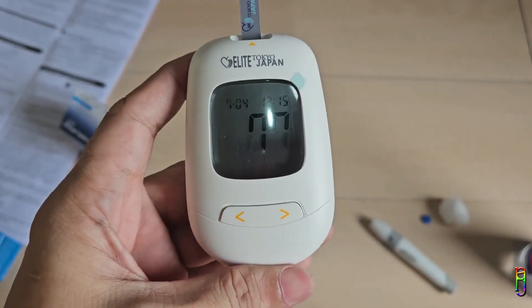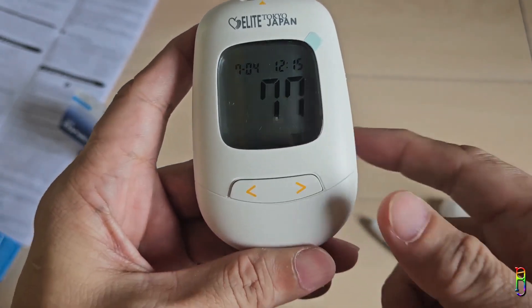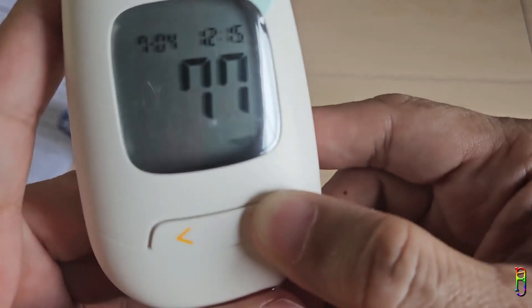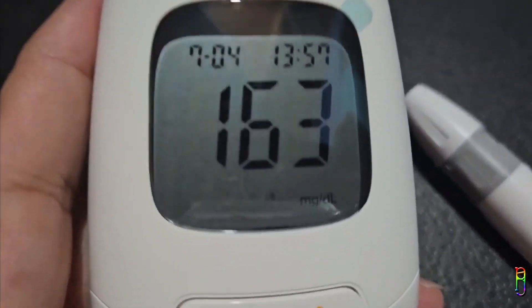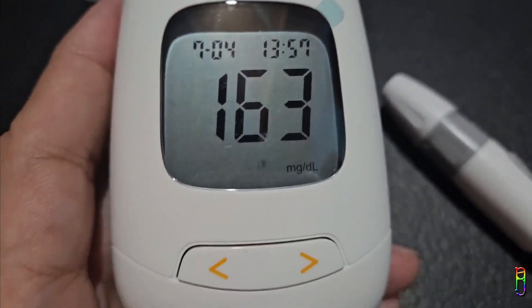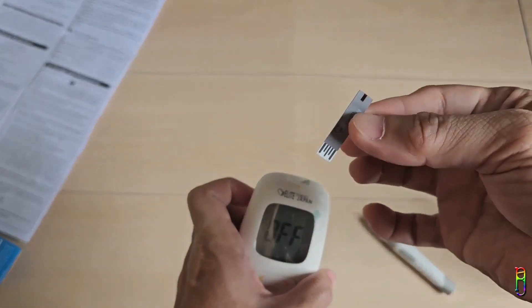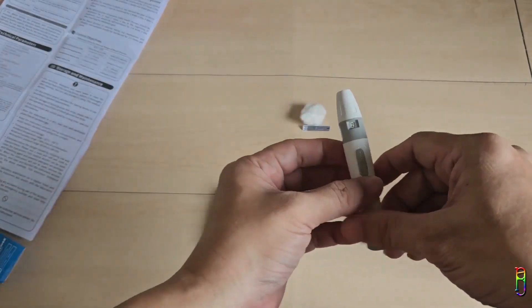The device will count down from eight seconds and display the result. I got 77, which is quite low — and I think it is accurate since I am really starving, with my last meal about five hours ago. About one hour after dinner I took another test and it is high now. My wife also took a test twice and we think the device is working well.